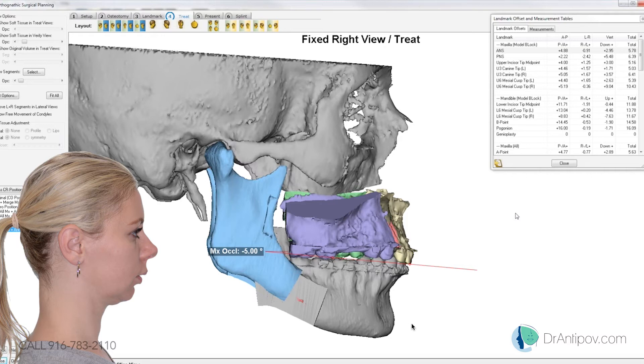So we'll come forward 4 and down 3 at the incisal edge. The right molar, we're coming down 9. The left molar, we're coming down about 2 and a half. And if we look at the mandible, we're coming forward 12 at the lower incisors and 16 at Pogonion.